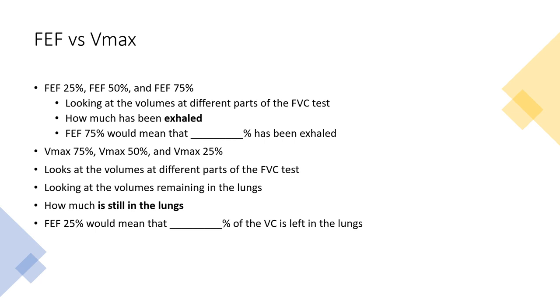Some quick notes here, FEF versus VMAX. This is just talking about words. Now, if you get really confused with words, skip ahead, and come back to this timestamp when you've got all the rest of the concepts down. So when you're looking at the FEF 25% to FEF 50% and FEF 75%, these are just different perspectives at looking at the flow rates, okay?